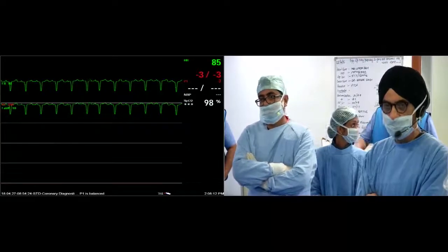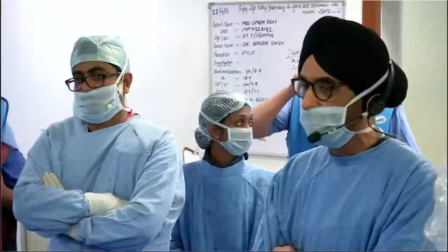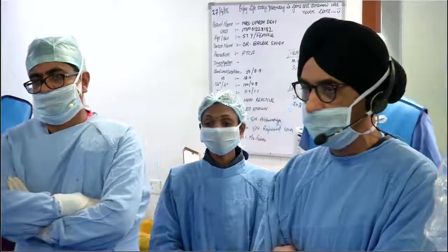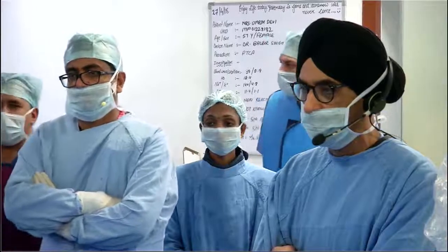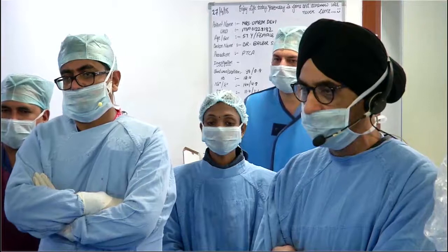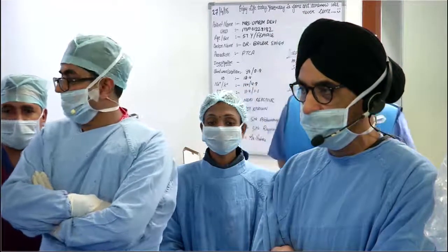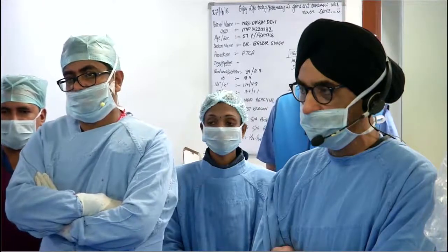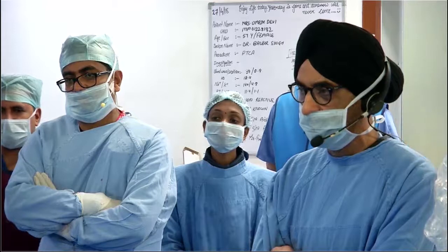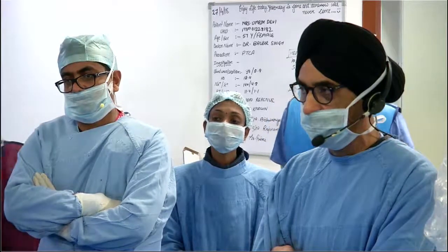Questions from the panel, for the strategy, for the three-vessel revascularization, the idea about OCT, how it helps as adjunctive technology. Hi, can I just ask you about the strategy that you've employed here? The Euro 2 score is about 3.2. I guess the SYNTAX score is in the intermediate range. Was there any disease in the right? I didn't quite see that. And a diabetic young patient who's got poor LV, just wondering what led you to the PCI strategy?